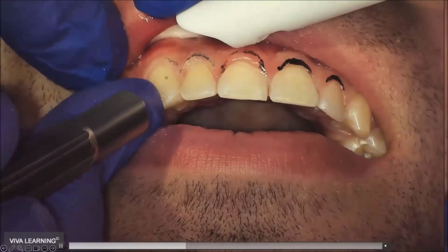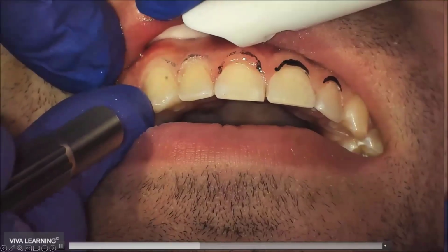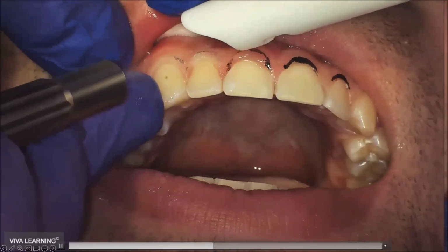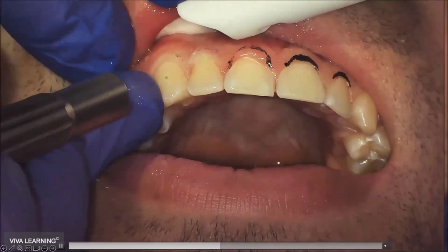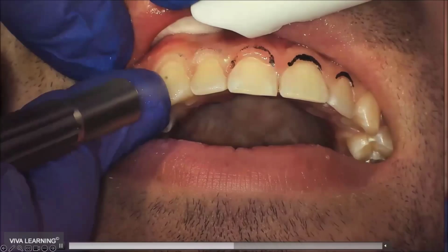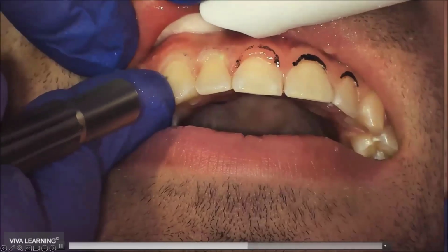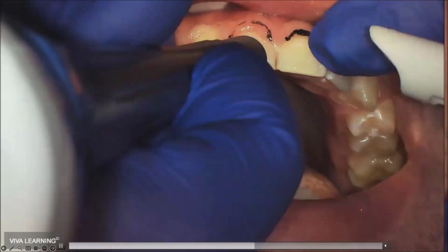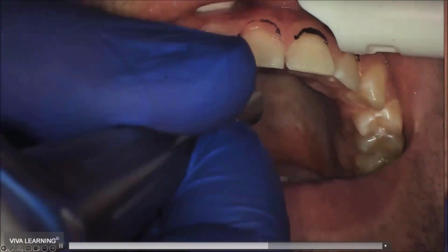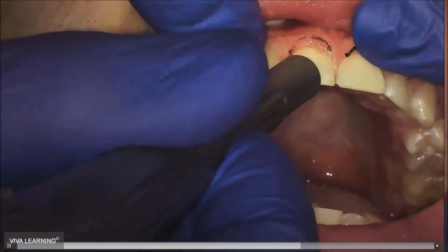Back to the analgesic effect, there was a question on, does it remove amalgam? So no, it won't cut the amalgam, but I do rely on the analgesic effect to, for all intents and purposes, shut those nerves down. And then as we go through there, I could pull out the handpiece and cut that amalgam out, no problem. Again, just seeing some of the sculpture happening there. And again, look at the lack of bleeding happening.